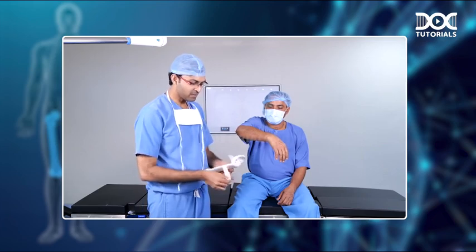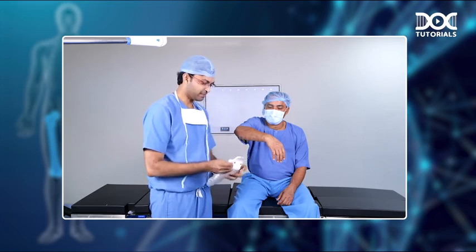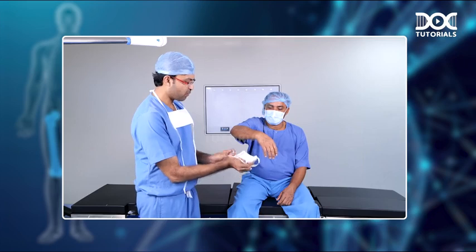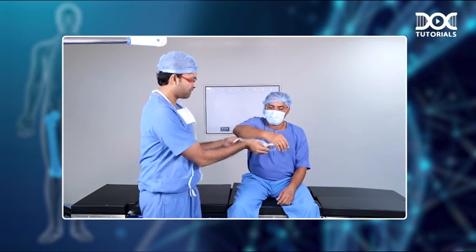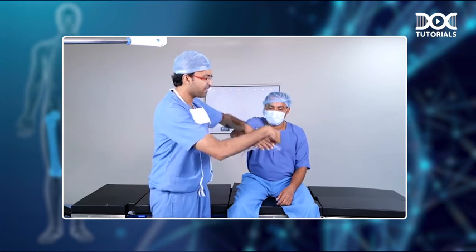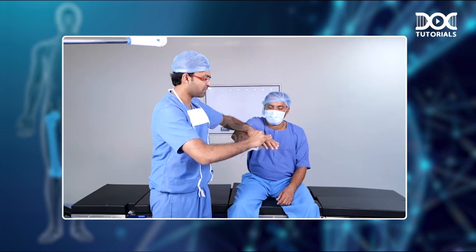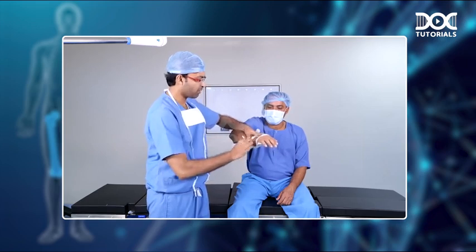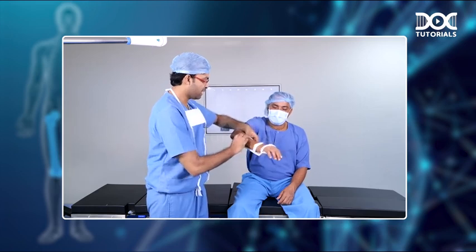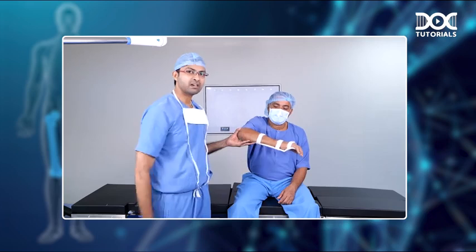It is very easy to apply. So you have these straps which you can open up like this. Then you place it on the volar aspect of the patient's forearm like this. You can see that once you apply this, the wrist by itself goes into dorsiflexion because of the support of the splint. So this is how you apply a cock-up splint. Remember, the cock-up splint is a very important spotter for your exams, and it is used in wrist drop, which is seen in radial nerve injuries.